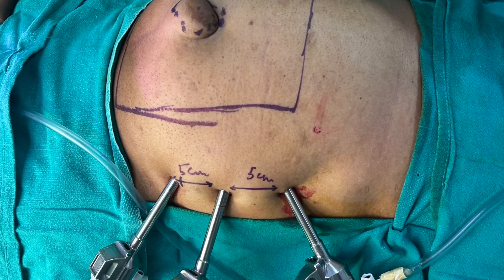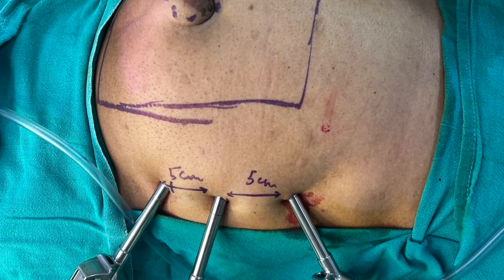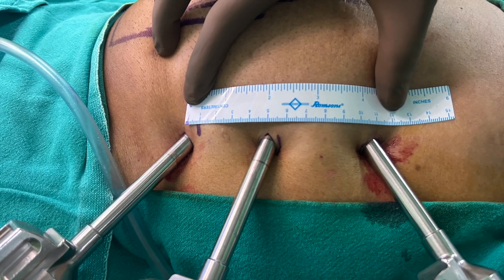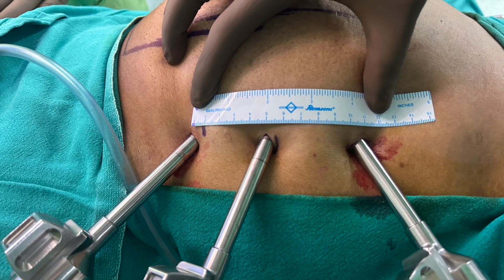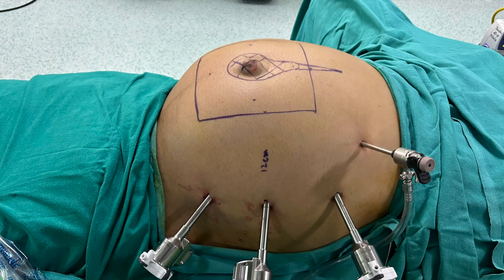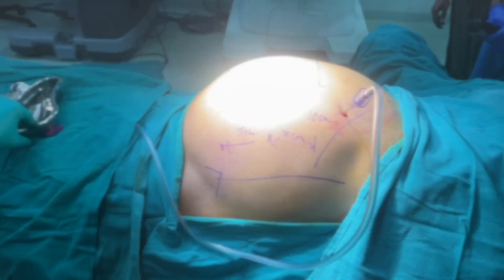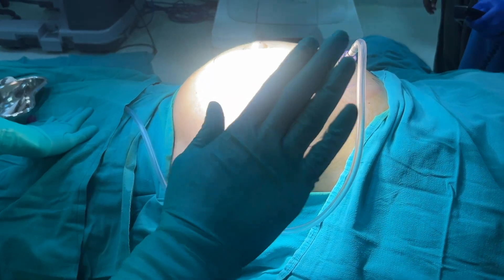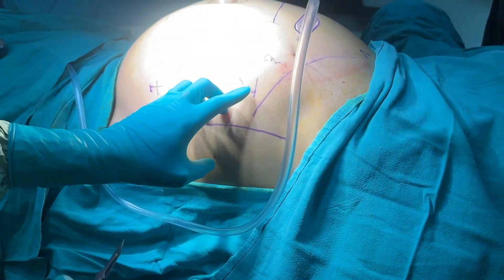You may not always get such a favorable abdomen — in cases where the abdomen is small, the distance between two ports might be a challenge, sometimes around 5 centimeters, although the recommended distance is around 8 centimeters. With time and experience this can still be managed. Early in your experience, you can start with a 5mm trocar from Palmer's point and then place the robotic trocars under vision. Before placing the first port, we give 20 to 30 degrees of left-up tilt to the table.